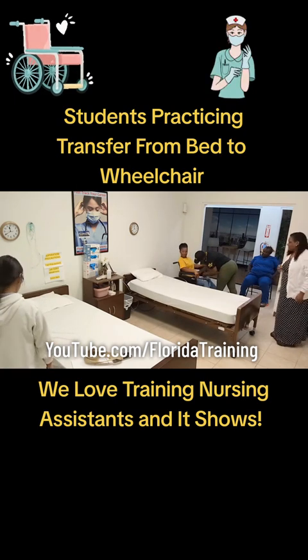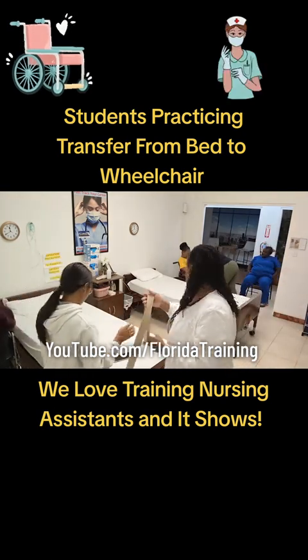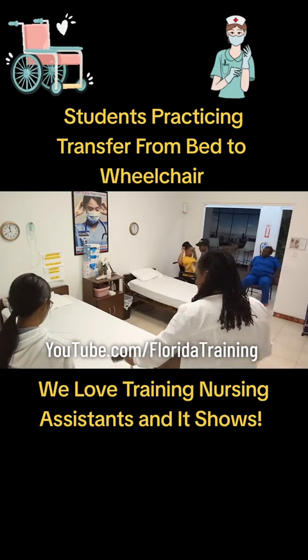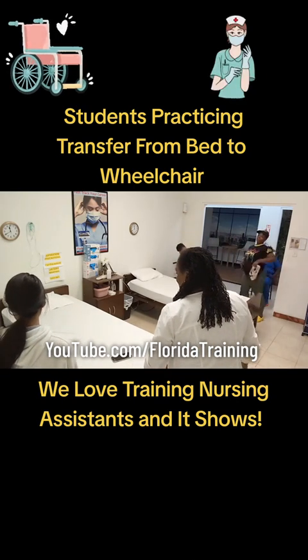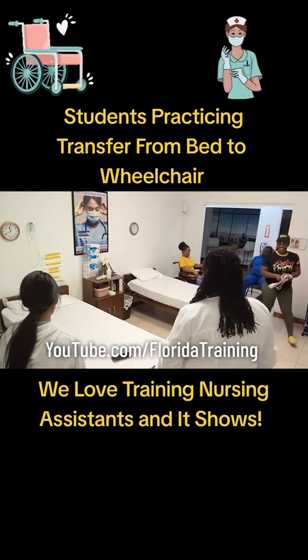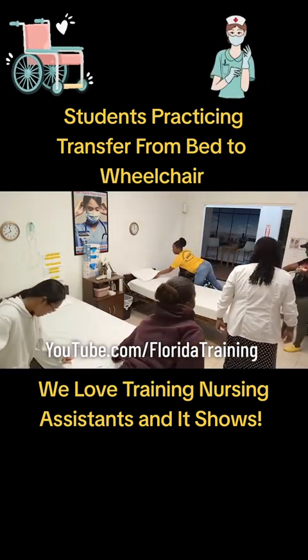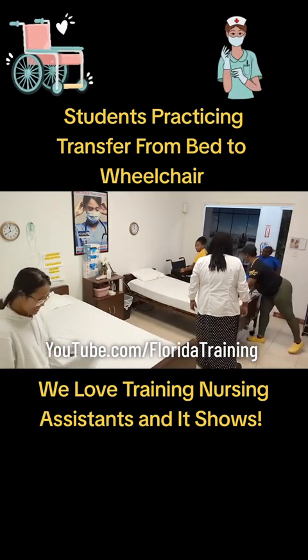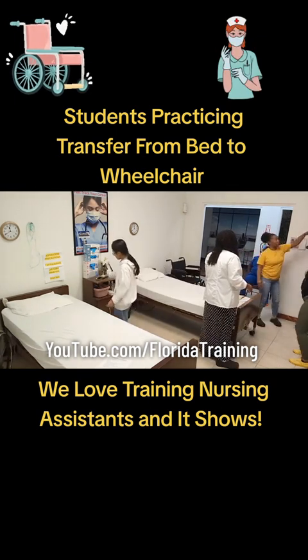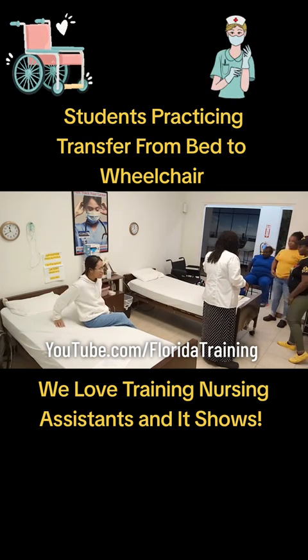Y'all can trade places — be careful. Rochelle, you're doing the most. Step back and let your partner get in the bed. Did you feel loved and safe as your partner was? So now whenever you get in the bed, just be careful because I don't want you to get in the wheelchair. Remember, start off with your wheelchair — prepare your wheelchair first.